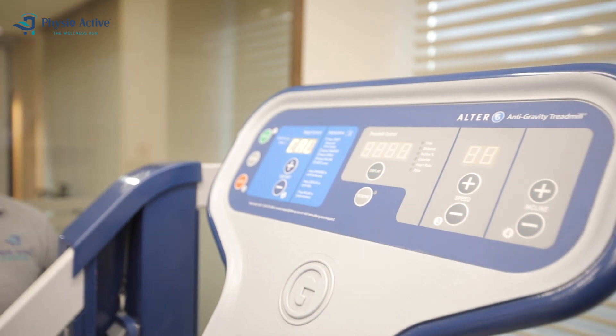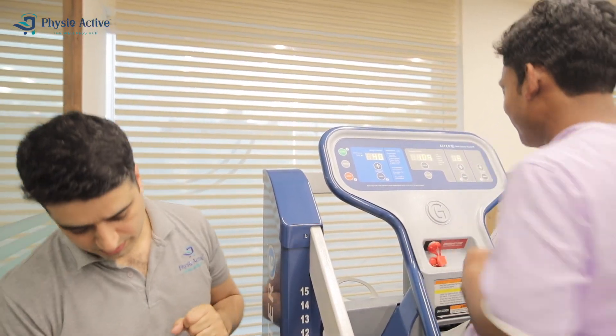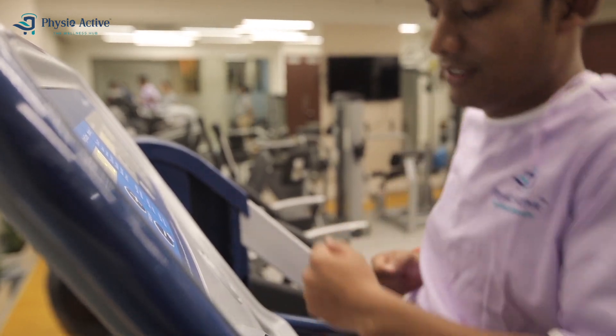By defying gravity, athletes can achieve dramatic reductions in impact and gravitational forces while walking, running, or engaging in closed kinetic chain exercise.